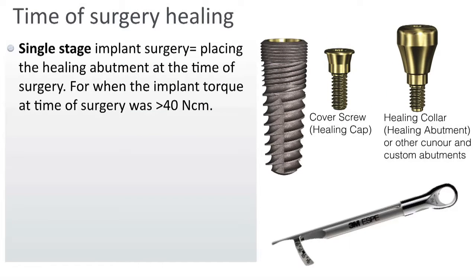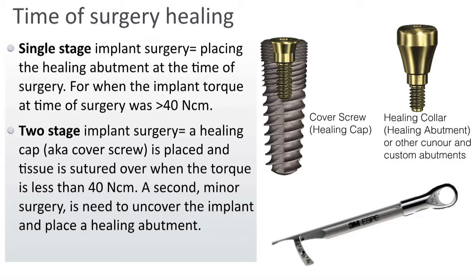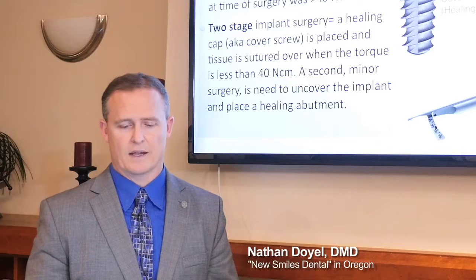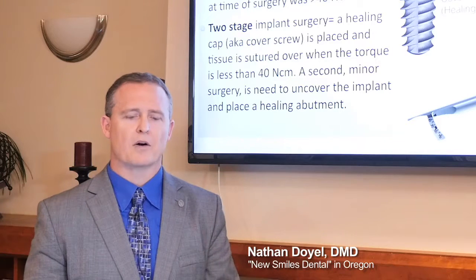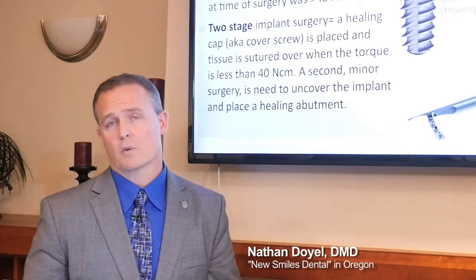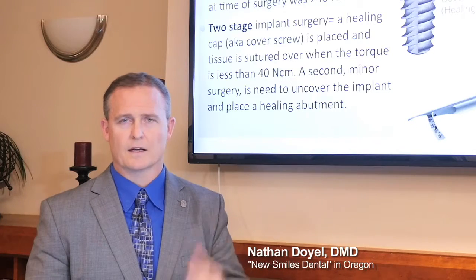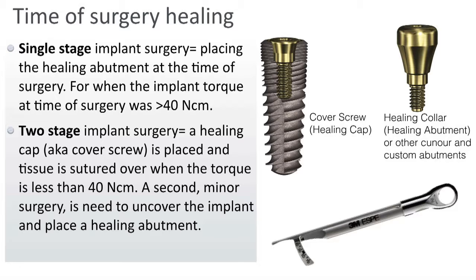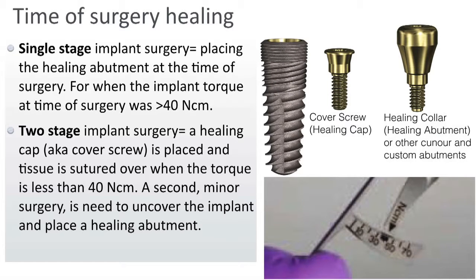If I put a cover screw on and it's buried underneath there and I have to go later and uncover that, that's the two stage surgery. I might choose that if I was concerned about the stability of that implant. If I have a torque less than 40, I might choose to bury it. But it requires a second stage surgery, a minor surgery to uncover it and expose that cover screw. Then at that time, I place the healing collar or healing abutment, whichever one you call it. It's the same, by the way.